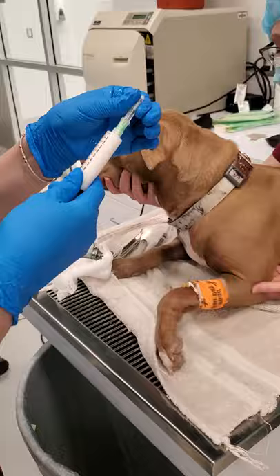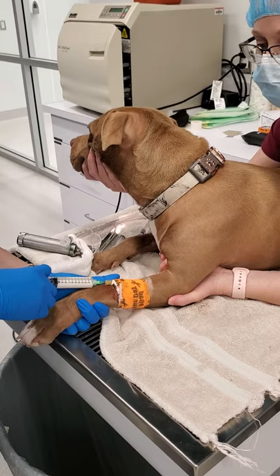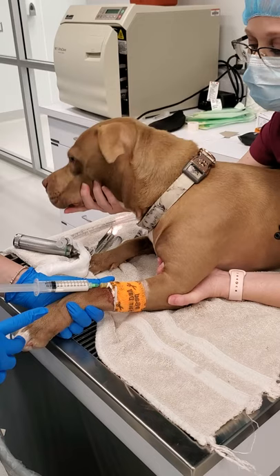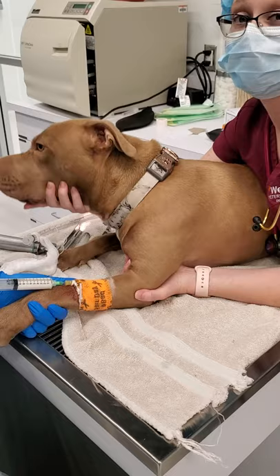I am now going to give her her propofol. How much do you give? Just enough to where she has no gag reflex. We give a little bit and then we wait. You'll notice I am holding behind her elbow — that's so she can't pull her arm back. I'm kind of just letting her do what she wants with her head but still supporting it.